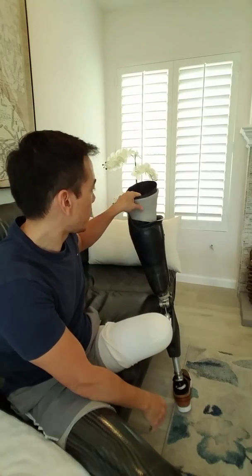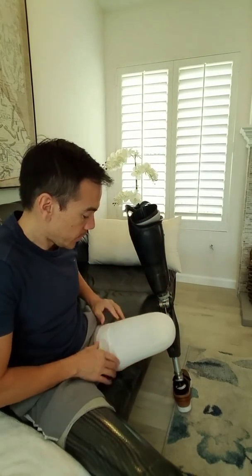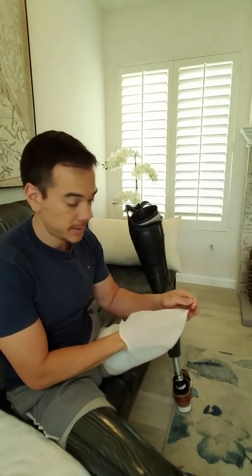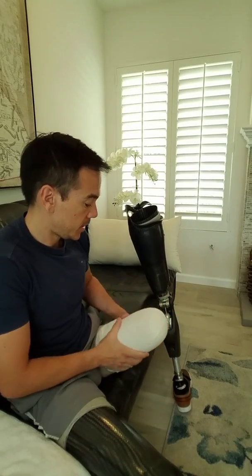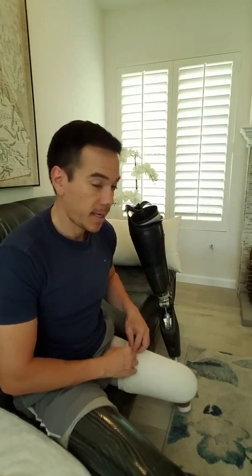And then I remove the inner cuff. I'm wearing three-ply worth of one-ply sock right now. What I like about this system is it allows for volume changes and fluctuations throughout the day or throughout your health. If I gain weight, I can take off a sock; if I lose weight, I can add socks.